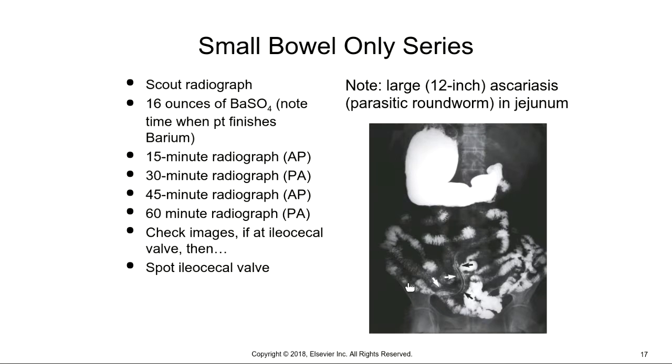So if they finished at 8:30, your first image would be at 8:45. Your 30-minute image would be at 9 a.m. Your 45 would be at 9:15. And your 60-minute image would be at 9:30. You have to take all 4 of those images.